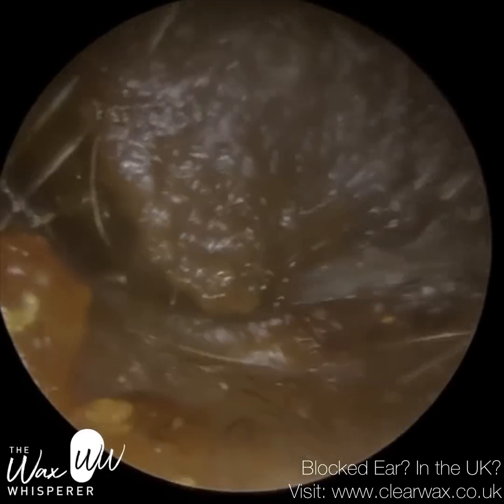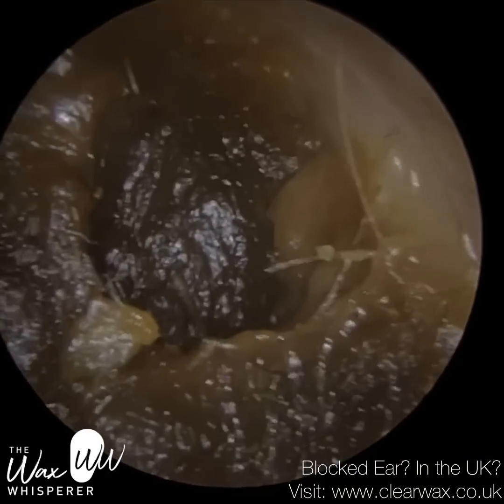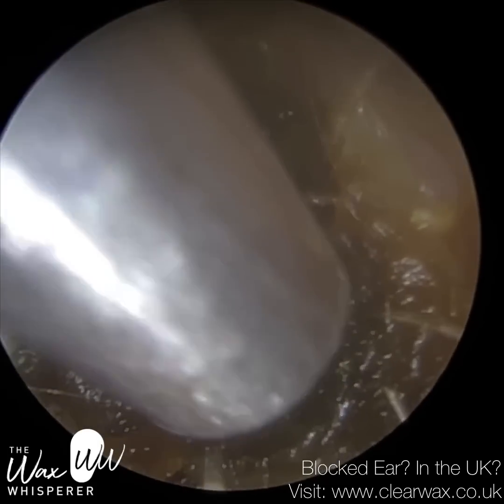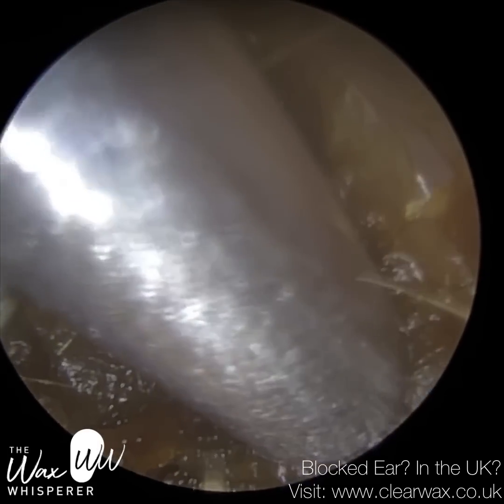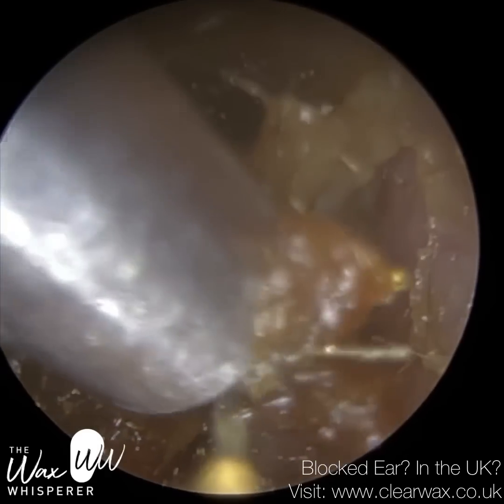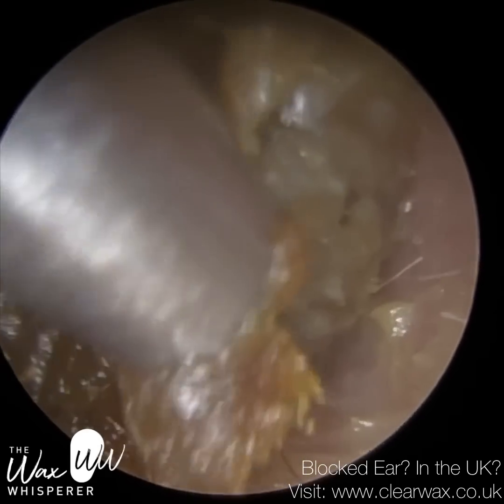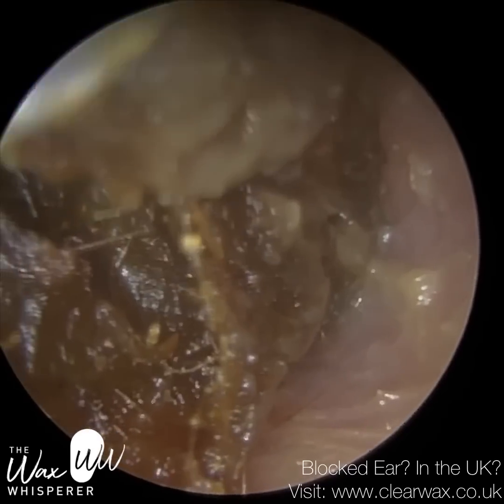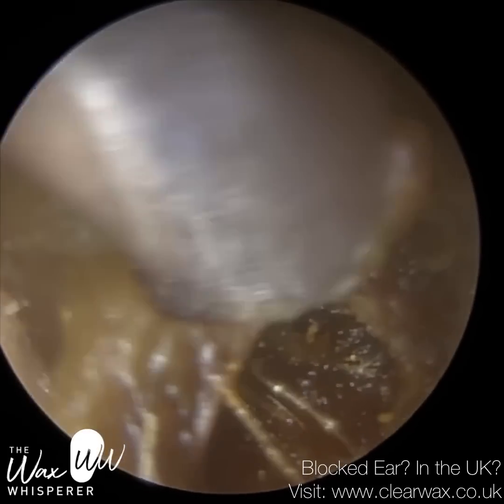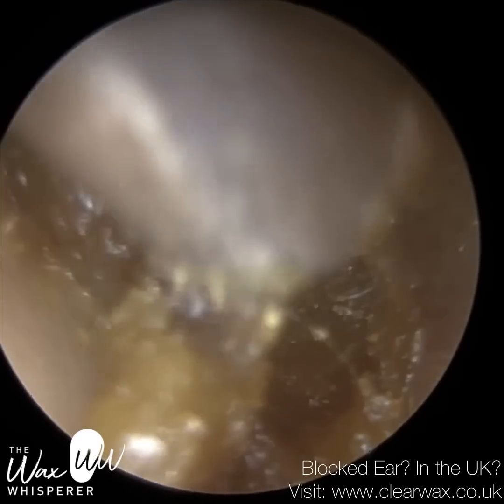We have here a patient who attended reporting a blocked right ear, and unbeknown to them, they also had a blocked left ear. It's completely occluded with earwax. So we're commencing with their right ear first, and after I removed the wax from their right ear, they then realised that their left ear was blocked. It's difficult sometimes when you've got one ear that's blocked than the other. You think the better ear is normal because that's your reference point for your bad ear.